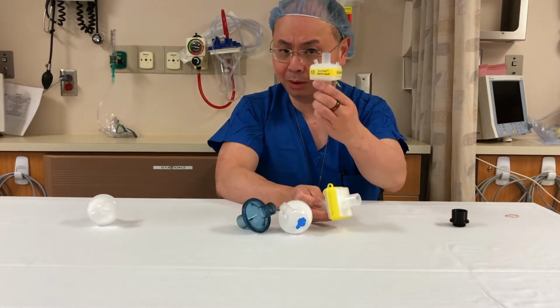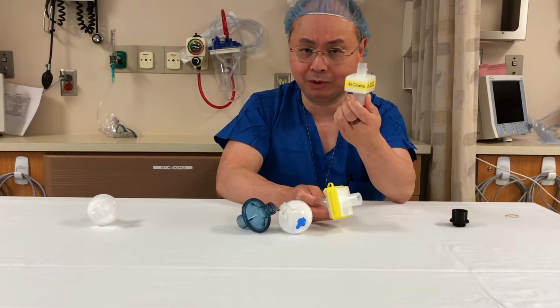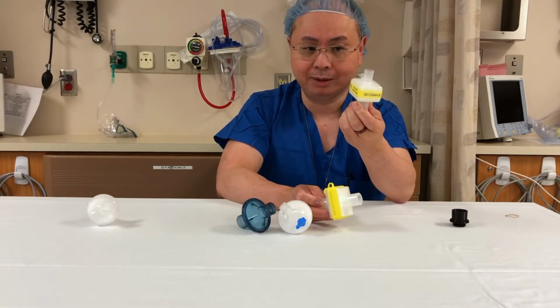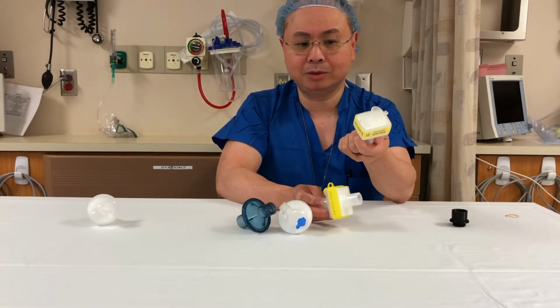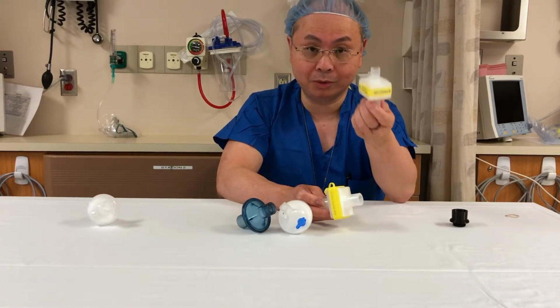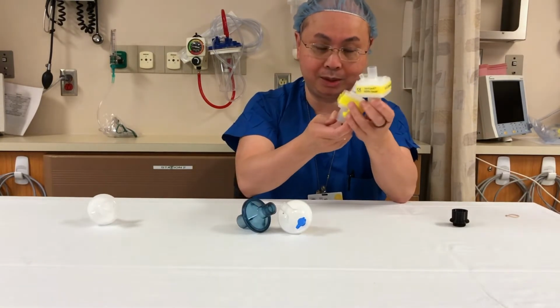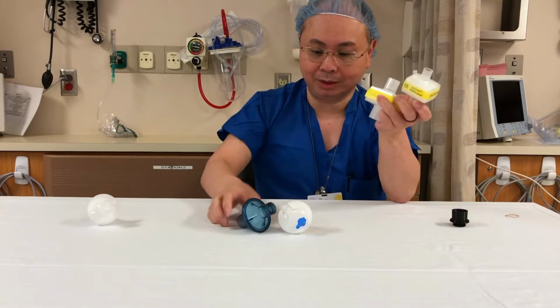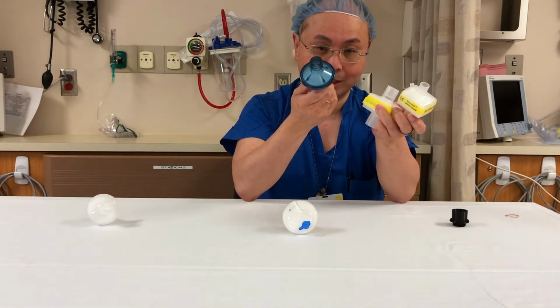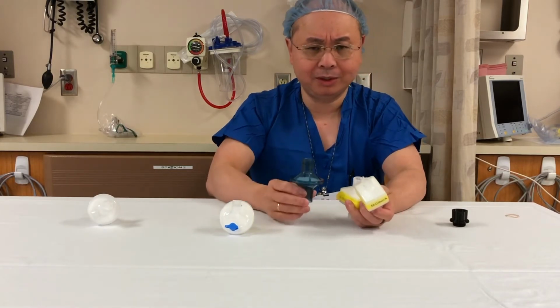Some filters are smaller. Sometimes with the smaller filters, you have to be cautious about how much flow resistance they would have. And this IsoGuard HEPA Small has a significantly higher flow resistance than the intersurgical HMEF, which is, again, double what the ViroMax filter has. You want the lowest flow. How much of a difference does it make?